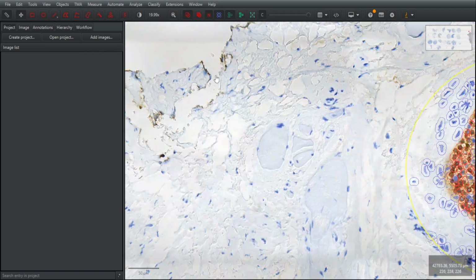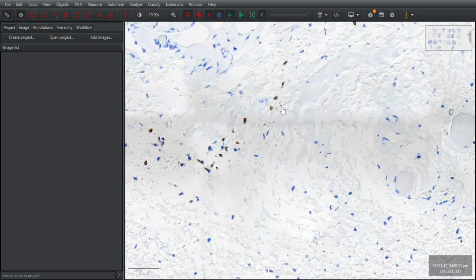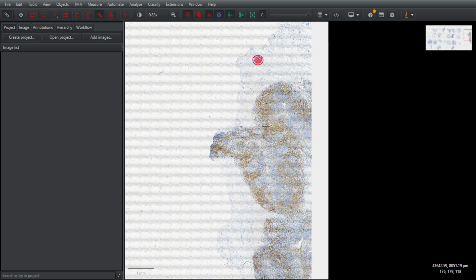Now coming here, you can find here that in these sites there are no proper CD3 cells, but here you can find a lot. So the same way which I told you before, just annotate it. If you find it difficult, you can go bigger. But I would suggest you use this method, the watershed method. It's called the watershed method, where it can completely do this, and from there you can detect it. Okay. So this is how it is done.